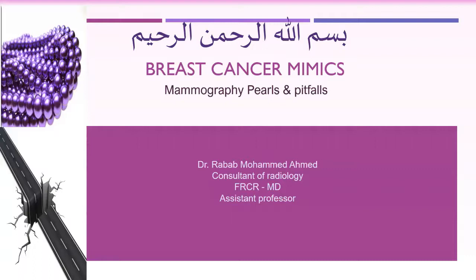Continue talking about mammographic pitfalls. Today we are giving the counterpart for the false negative. Today we are going to talk about the false positive.